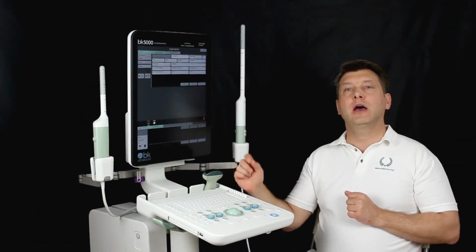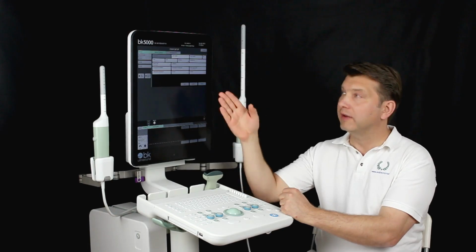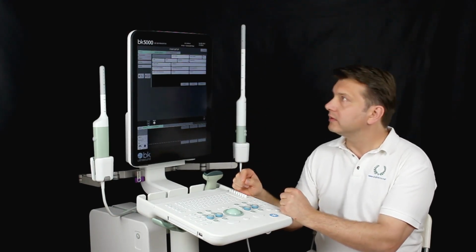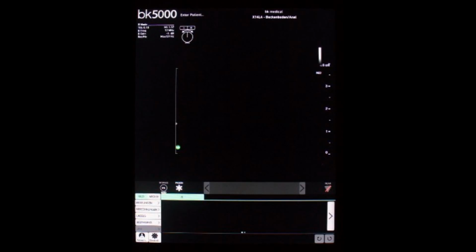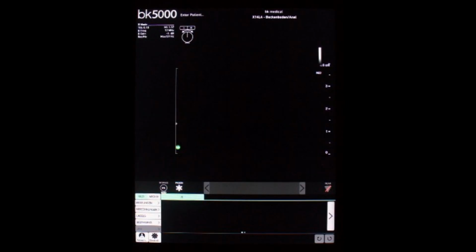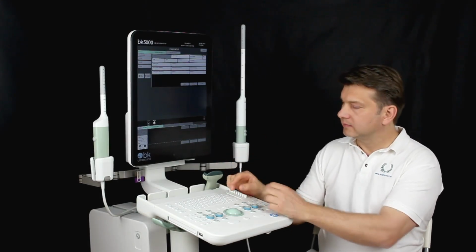In this video I show you how to operate the ultrasound scanner BK3000 and 5000. First we need to perform the patient ID input. We press this button, then this table appears. We fill out these values and press Next.